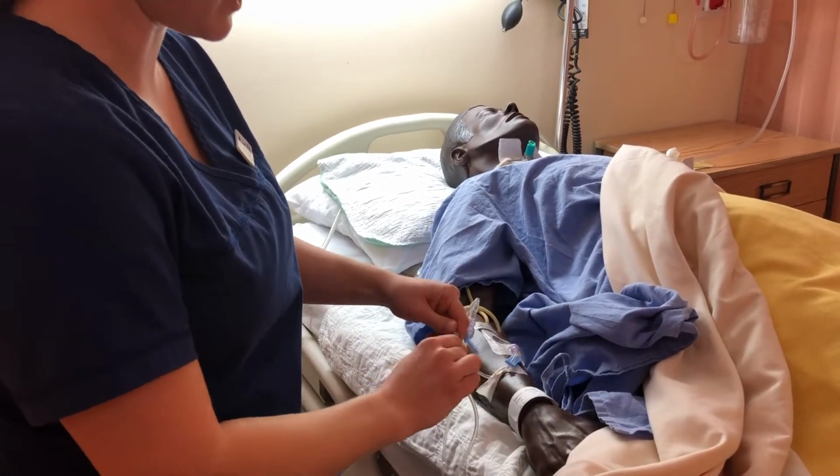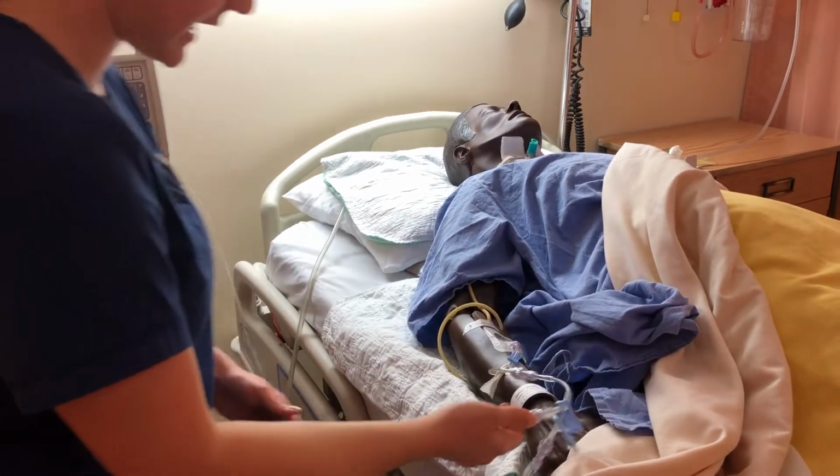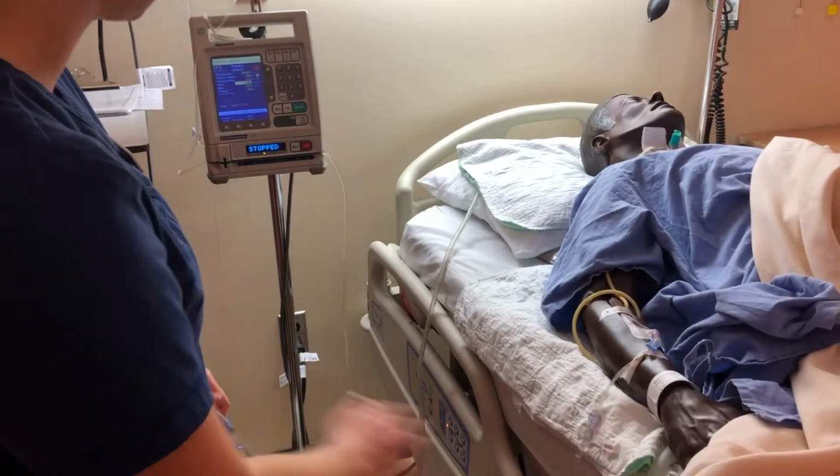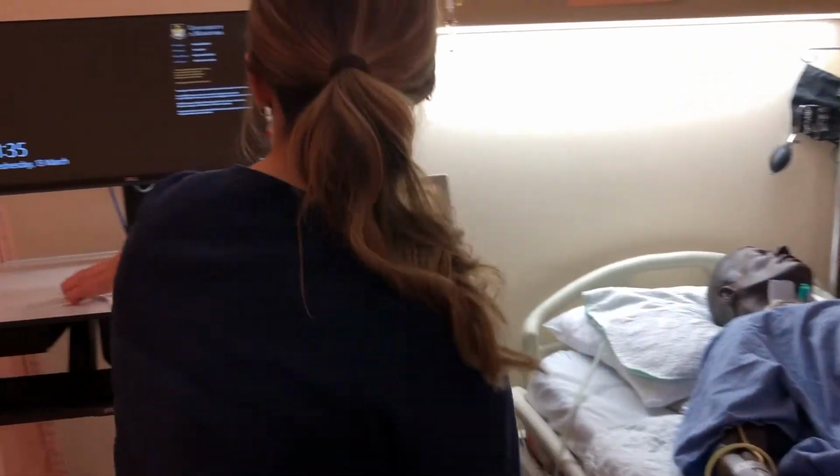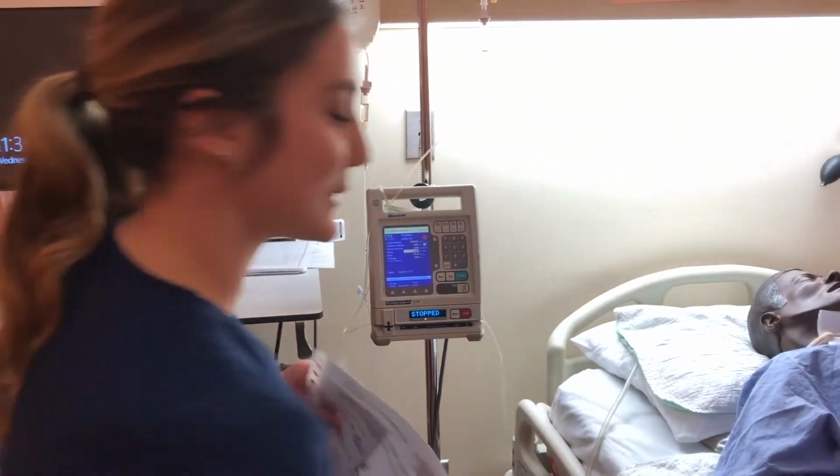And now I can connect my lines. But I'm not going to start it yet. I'm going to make sure my clamp is closed. And I'm going to get a second nurse to come check. I'm going to do my second check first.